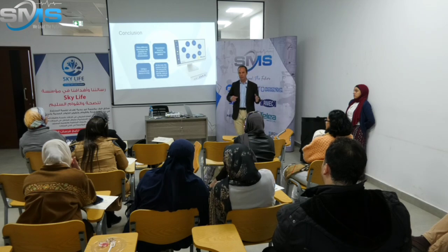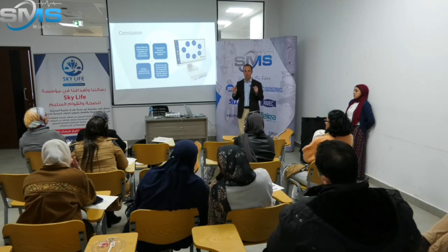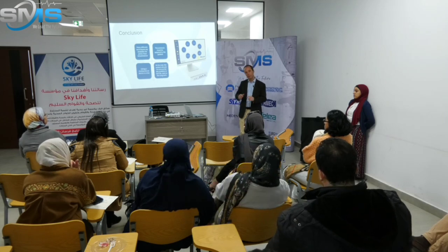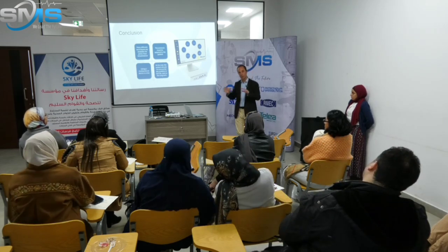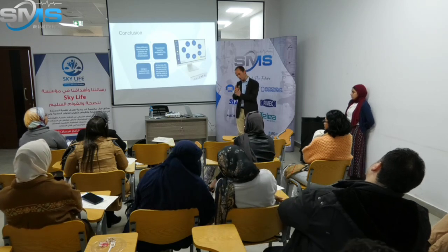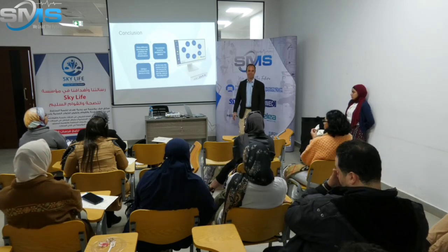Because you need everything: you need her to be able to contract correctly, long time, peak time, whatever. And after that you can work standing up and do some exercise. That's the end, and when this is correct, you've done a good job.